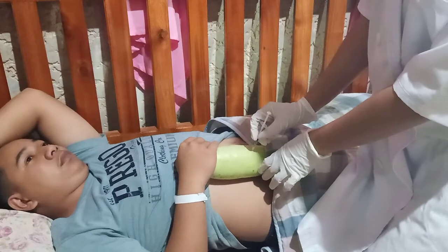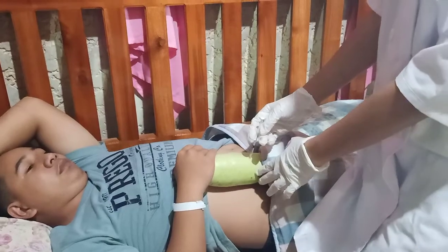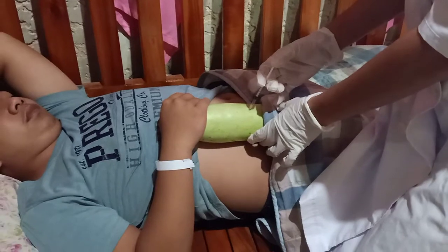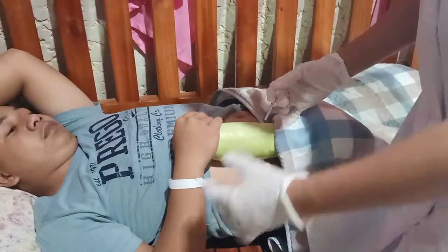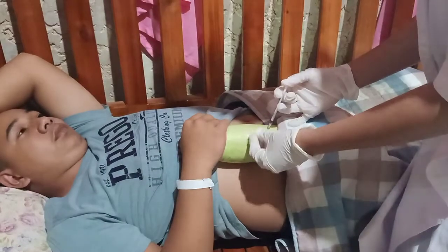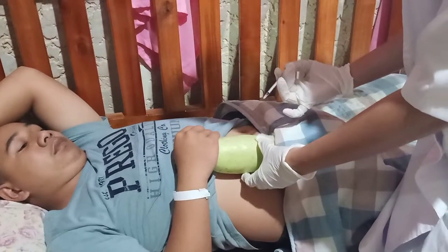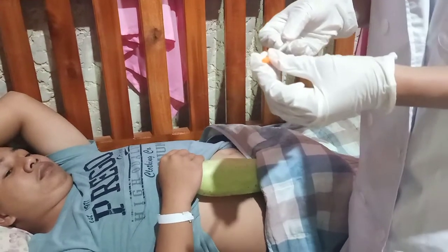Move the dominant hand and slowly inject the medication over several seconds. Then quickly withdraw the needle and place a swab. And do not massage the area.